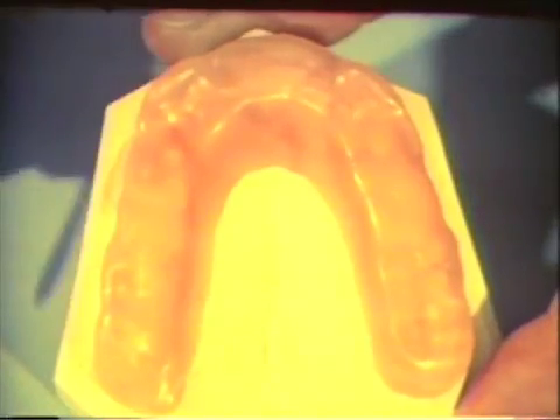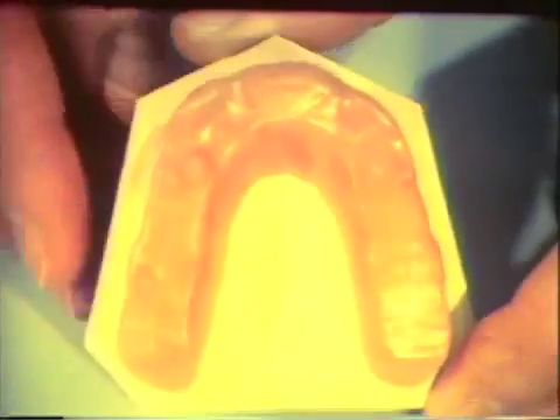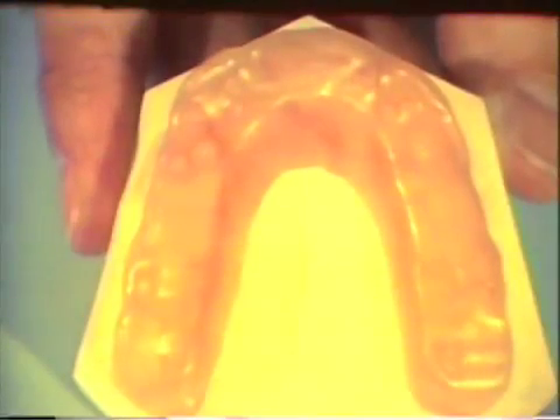There is a two millimeter distance between the imprints of the lower incisor teeth and the palatal shelf on the bite plane. The wax-up is now ready to be processed in heat-cured clear acrylic.